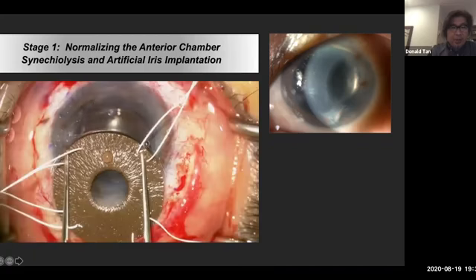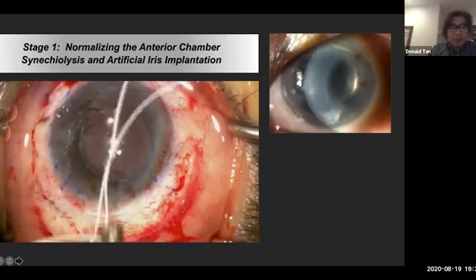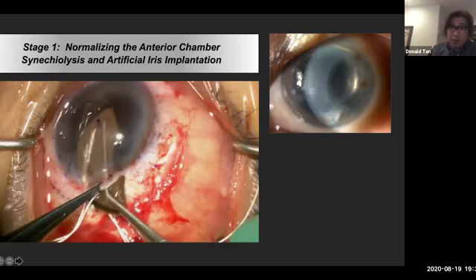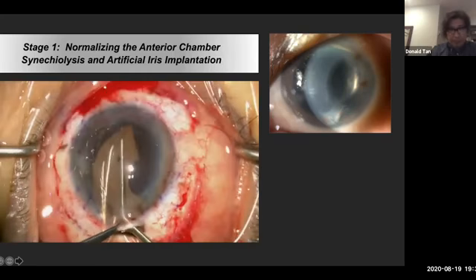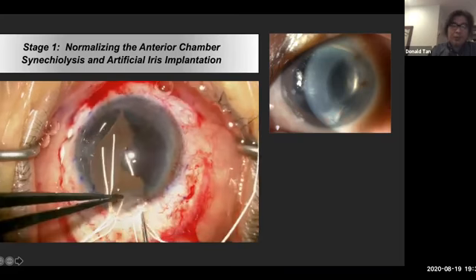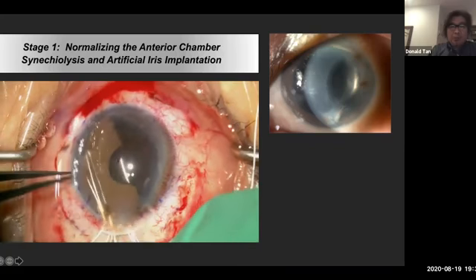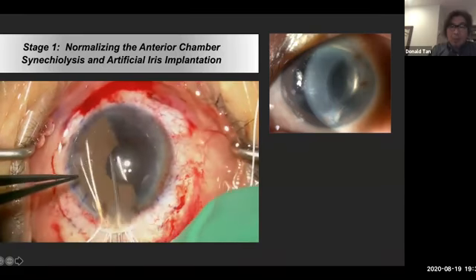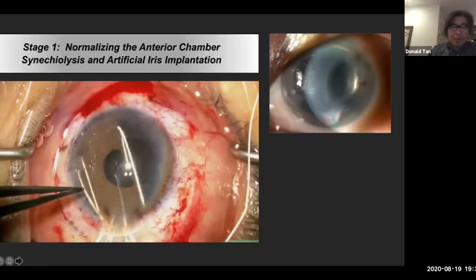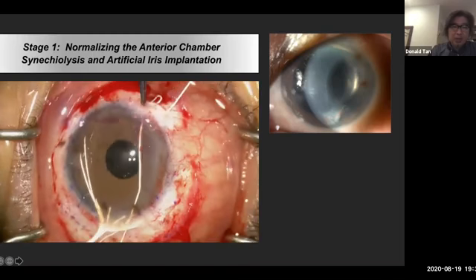Here's the pre-placed iris, trephined and sutured. And then I put it through, in this case, a 4.5 millimeter incision. I have to be careful not to dislodge that IOL. The fortunate thing, of course, is we're going to do a DMEK anyway, so we don't have to be too worried about damaging endothelium here. I'm more worried about not displacing that IOL. A little bit of manipulation, you can see it opens quite nicely, and then I fish out the incisions.